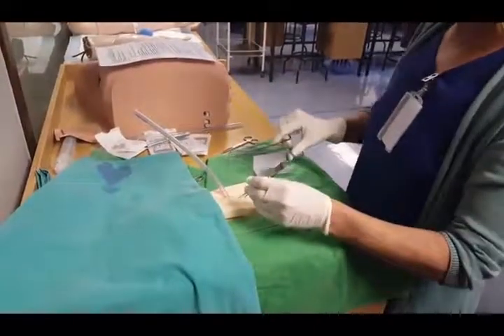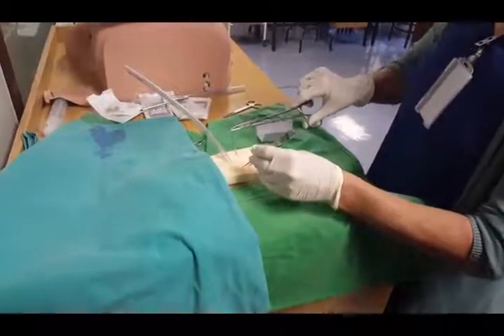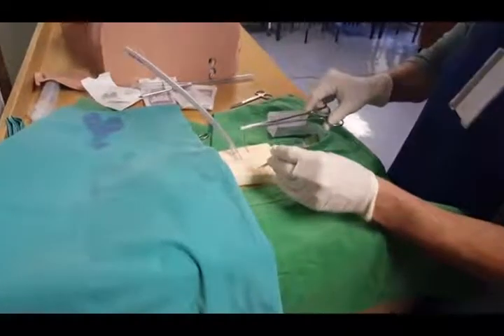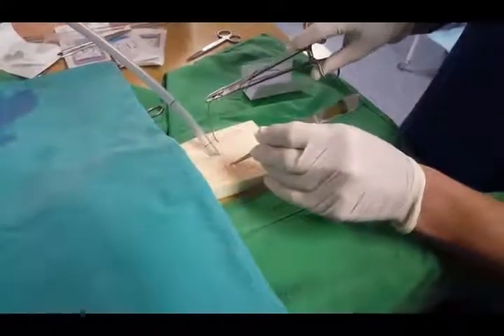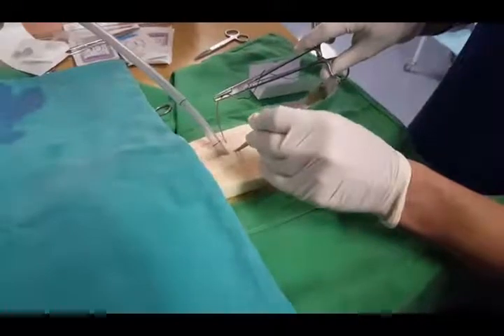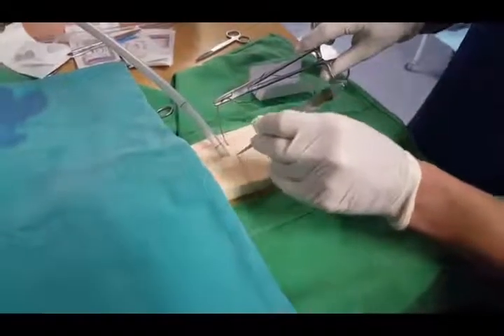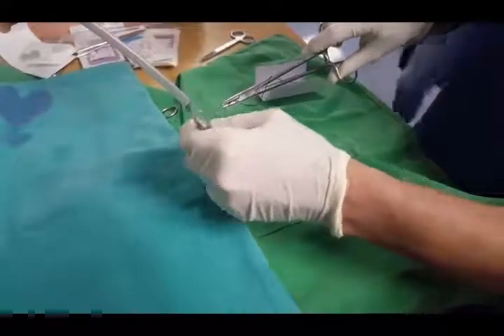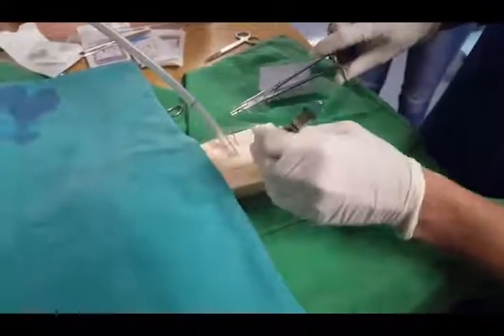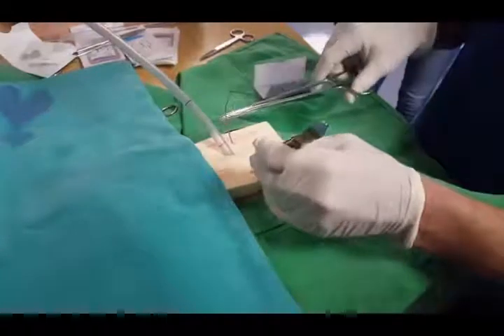What you're going to do is go in far and deep. We actually want to go in a little bit closer because this is going to be your central suture — it's going to hold your tube in place. You want your tube slightly off center, going to one of the sides, going far and deep.